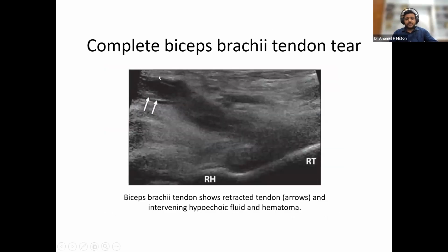Here the tendon is not seen completely, but you need a maneuver like the heel-toe maneuver or the cobra position. You have to see whether this tendon is complete or not, because when you give the opinion that it is a full thickness tear, that is a very crucial thing. If it is a partial tear or tendinosis, you can treat it yourself. If there is a full thickness tear, that needs surgical intervention.